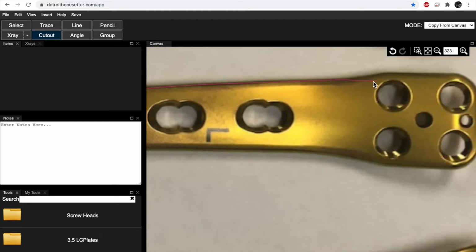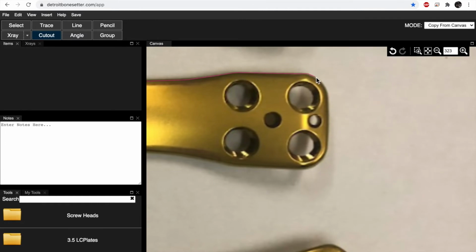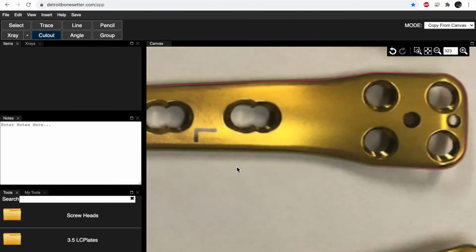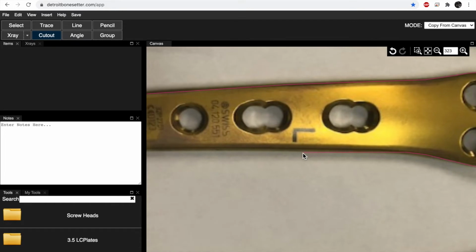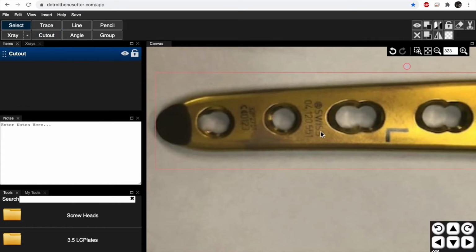I'm going to move it along, just using my fingers, and I'm clicking every time I come to an edge. And then, whoops, let's go right to there, there, there, there. Come over here. There we go. And I'm going to bring that over, so then I'm going to go like this, here, here, here, here. Here we go, all the way around. And now I have a cutout.